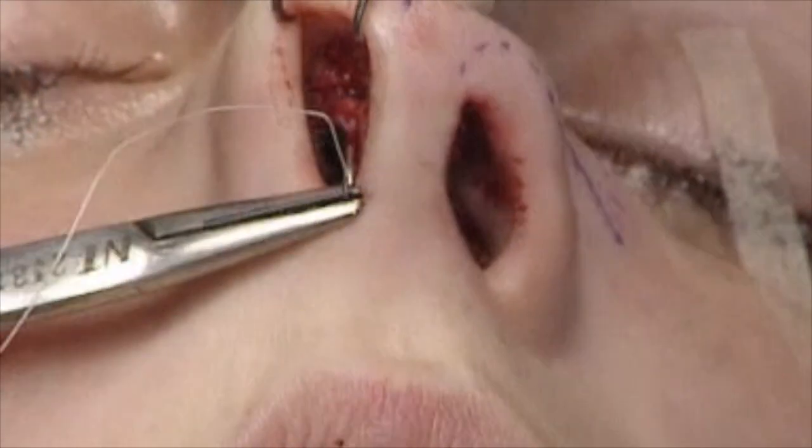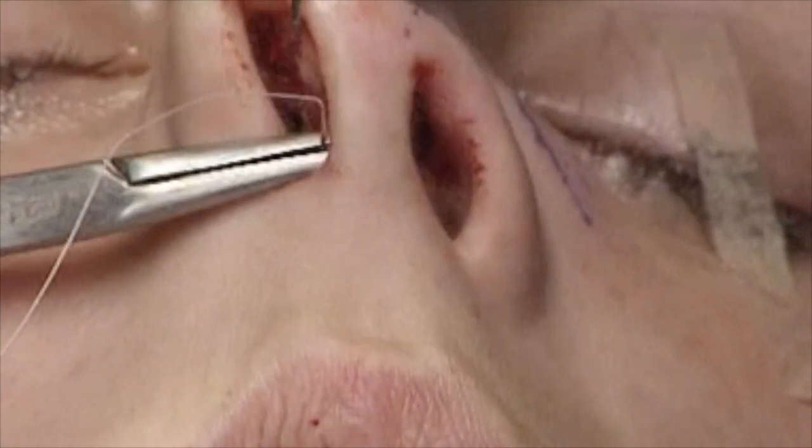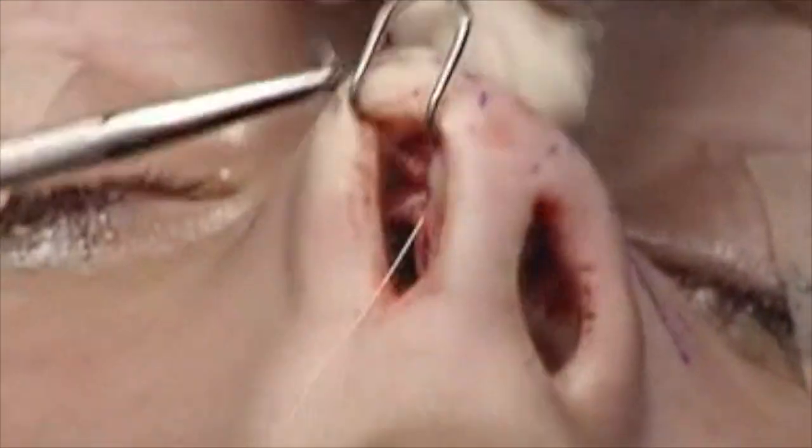It's important just to close the intercartilaginous incisions at the point of the transfixion and intercartilaginous incision.